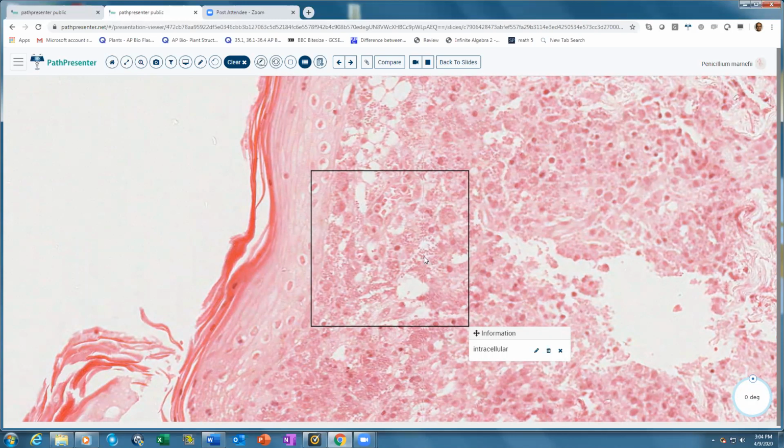And this is scanned at 20x, so if you have a glass slide, it is much easier to go at 40x and see them. And the one feature that they talk about is you may see some septations within them actually, because they divide by binary fission. So that helps you out sometimes when you have a slide that you can go up to 40x and look at them actually.